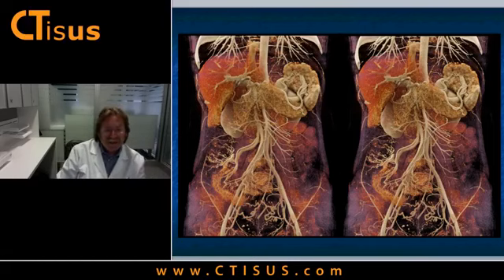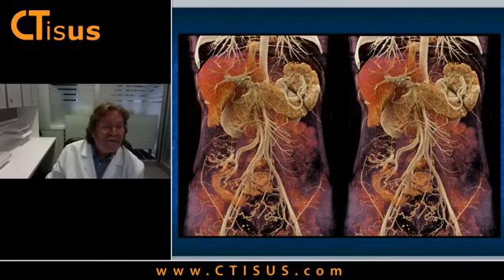I was showing some cases yesterday to the surgeons in the pancreatic cancer conference. So I'm using cinematic in cases where we're looking at potentially planning surgery. In this one case, we were looking at a patient with a neuroendocrine tumor, trying to define resectability, and it can prove to be very helpful in that regard. I think we are looking very carefully at how to integrate this in our practice. The good news is the process doesn't take all that long, but it still takes time. You've got to figure out in what cases it's going to make a difference.